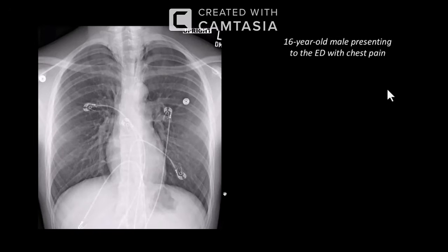I will convey my finding to the referring physician and inquire about the cause of the pneumomediastinum. If the patient presents with severe vomiting, a CT scan with oral contrast can be done to rule out esophageal injury, and the patient should be monitored carefully for any further extension of the pneumomediastinum.